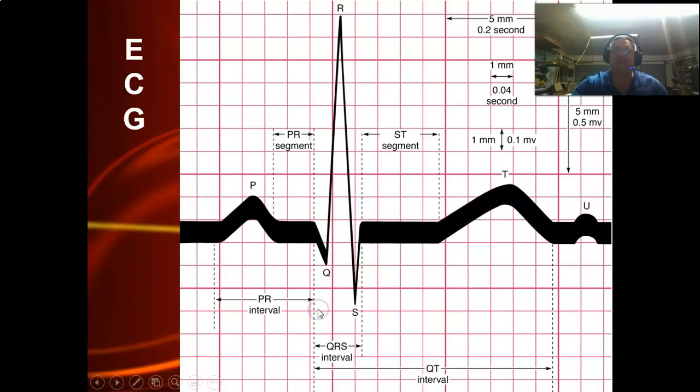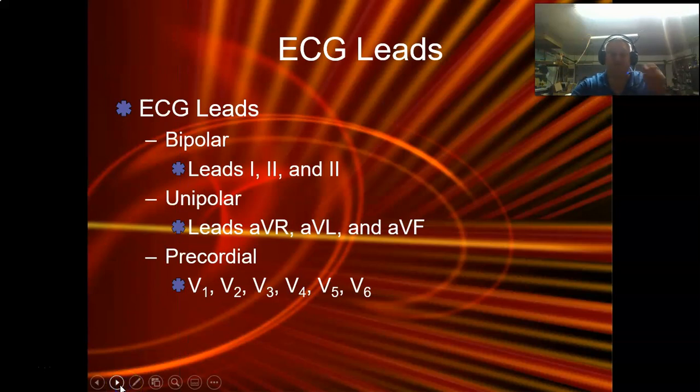And I've stressed this to you guys, and by the way, this is a wonderful slide that you should probably take a picture of, because simply put, it has all the measurements in it and where they are, and how we measure things, okay? So it's very important to understand these concepts with the EKG right here. If you have not already learned this, I would highly make sure that you know this slide, because it's really going to come into play as we start doing the 12 leads.